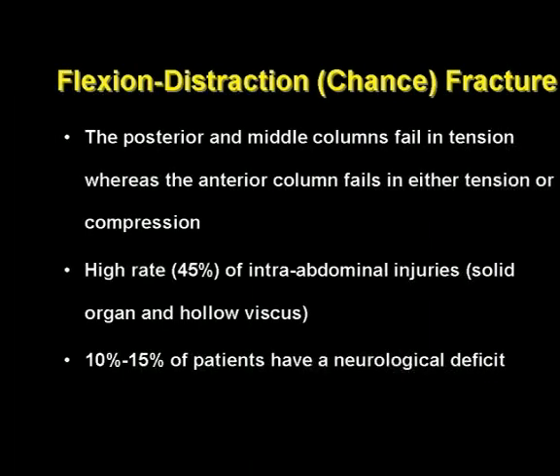And as radiologists, nowadays we do a lot of CT. We average about 8 to 14 CTs a day doing things like this, but we're also doing acute trauma, trying to see how well the screws are in the pedicles, whether they are inside or outside, and the multi-slice CT has really helped us with this.